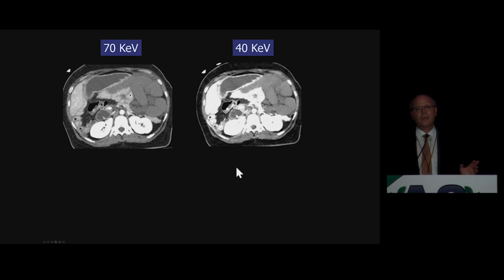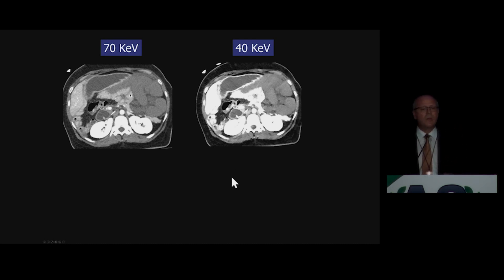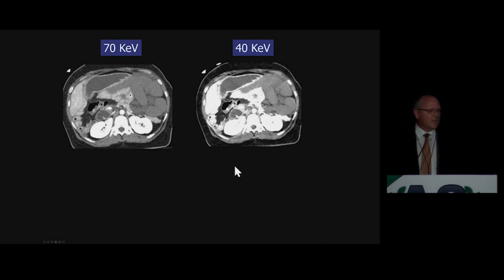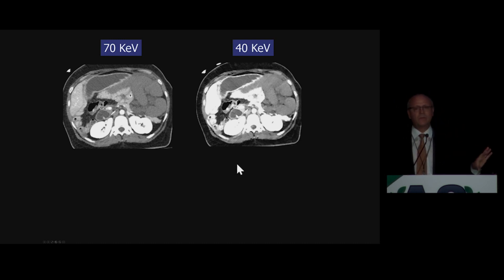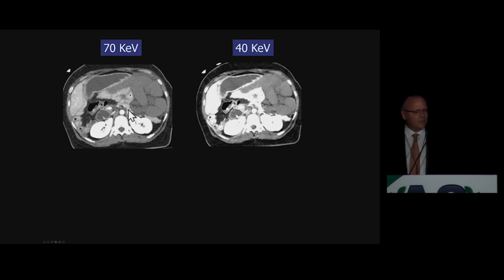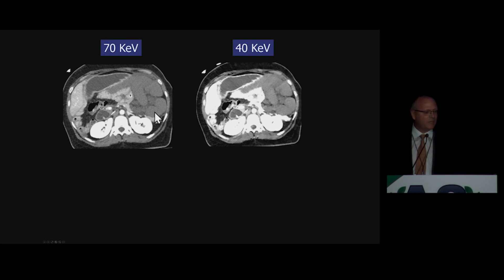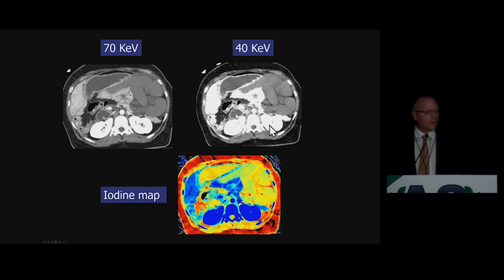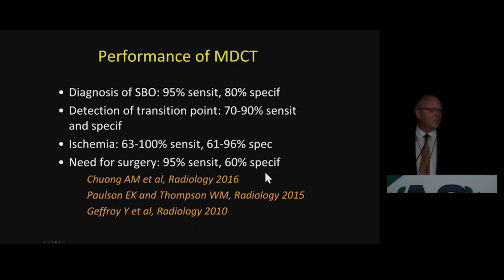We routinely acquire or generate several multi-energy series, send all of them to the PACS, and use them in our diagnostic workup. There's no question that this patient has not only ischemia but necrosis of a long segment of bowel, and it's more evident with a 40 keV image and even more so with the iodine map — illustrating how dual energy CT can be used in this setting.